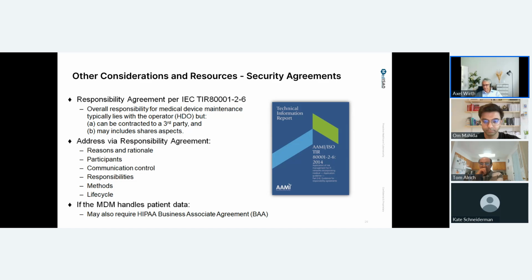Also, more and more, of course, medical devices connect to a cloud service, an additional service that the medical device manufacturer may provide, including cloud services related to maintenance and management, but also cloud services related to patient data management and analysis and whatnot. And if patient data is involved, then under HIPAA, the medical device manufacturer becomes a business associate, and therefore a business associate agreement under HIPAA would be applicable and would need to be enforced, including things like breach notification.